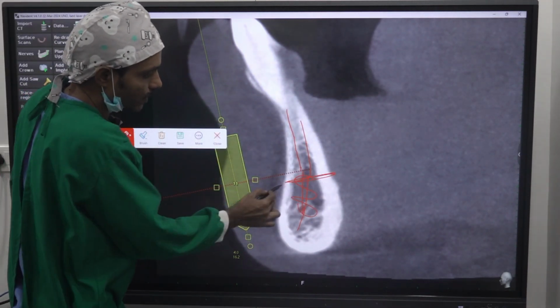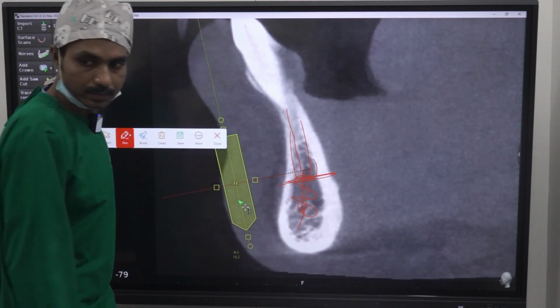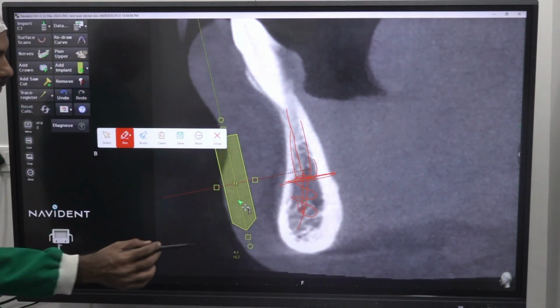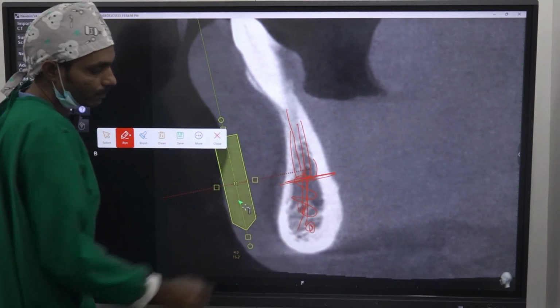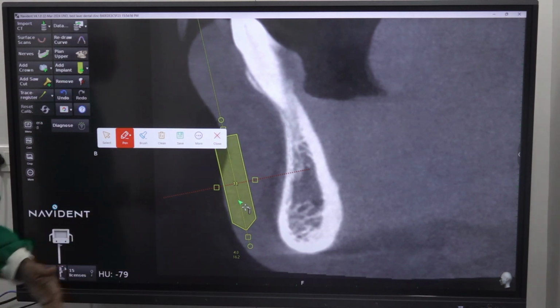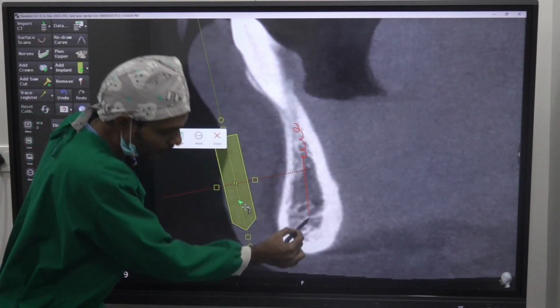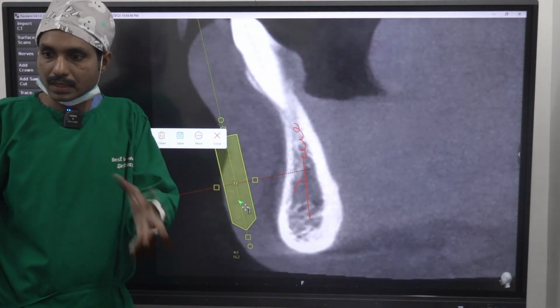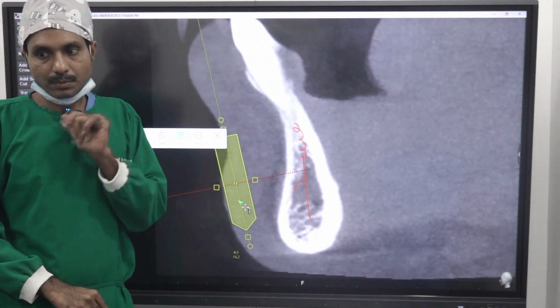That is because you are crossing beyond that. So if you are placing basal, make sure you are staying within this limit, not going here. If you are using a compression implant, you can go till here. But if you are using basal, without CBCT, how will we know this? So during drilling, feel it. You will feel resistance here. Suddenly, you will feel the drop. That means there is cancellous bone here. So plan accordingly.